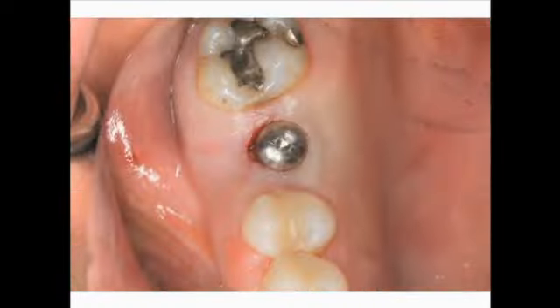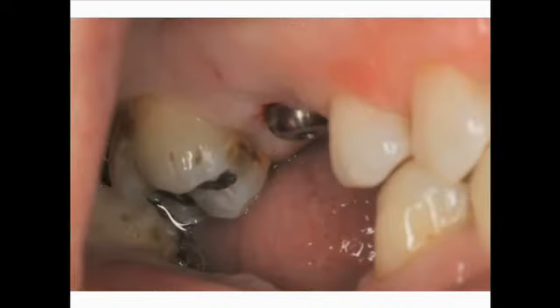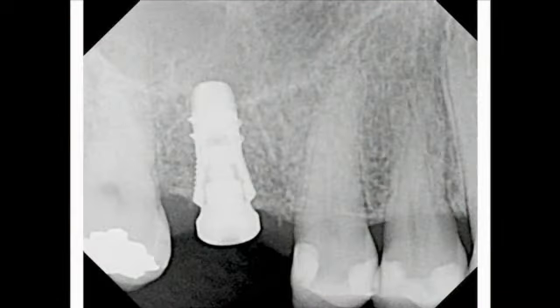And here we can see the healing abutment in position, very little or no bleeding, no sutures were required. This is a very non-invasive treatment. Facial view of the same. Here we're showing a radiograph of the Cybron Octa implant in position immediately after surgical placement. Note the platform switching design of the healing abutment.